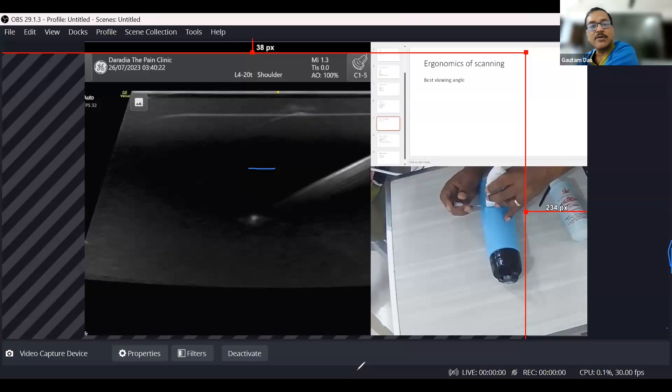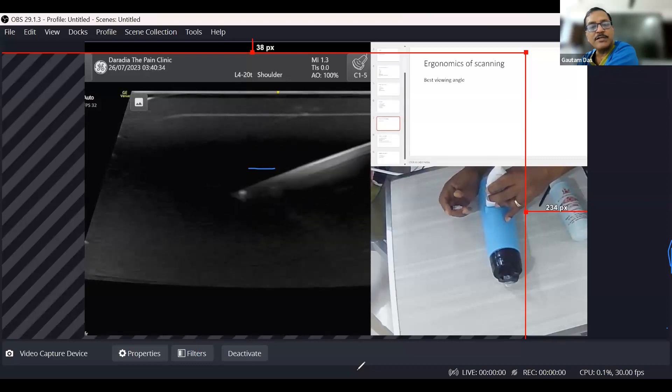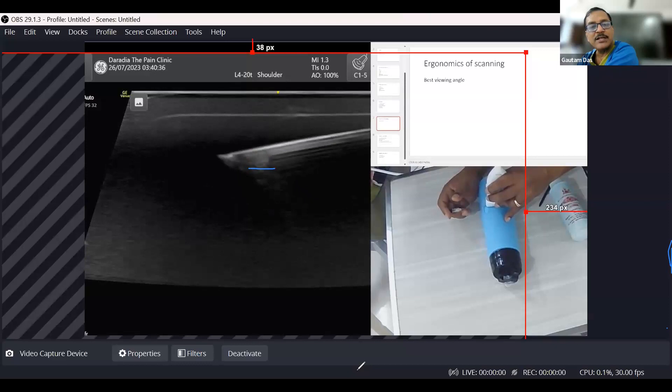The needle is almost vanished — I cannot see it nicely when going at this angle. At 45 degrees I cannot see it at all; just tip movement is seen. But when I lift it and the angle is decreased, the needle is best seen again.